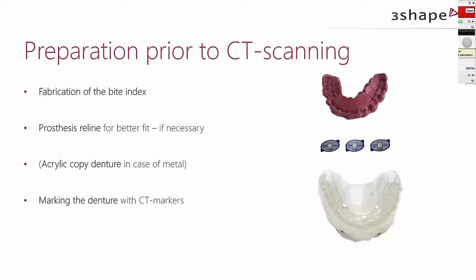I believe the ones that we have had hands-on and made tests with, and also had users making tests with, are manufactured by a company called SureMark. We don't have anything to do with them, but it seems to be a really good solution, and we hear really good feedback. Yeah, and it's very nicely visible in the CT scans once you import the scan into Implant Studio. This is what we definitely can share with you. And they also seem to not cause a whole lot of scatter and artifacts, which is very important. So they seem like a really good alternative.